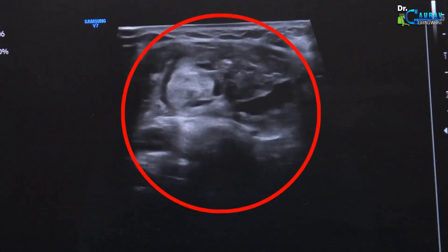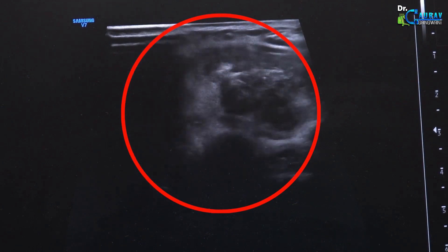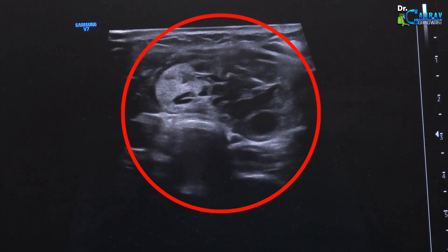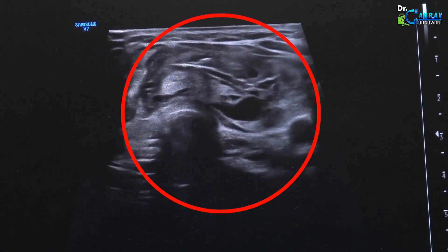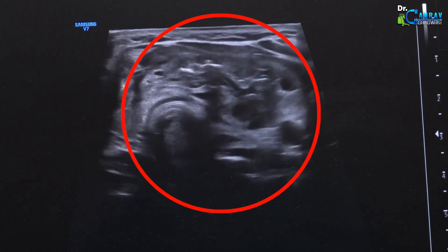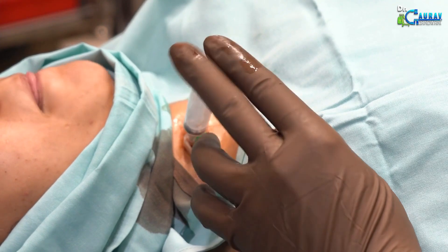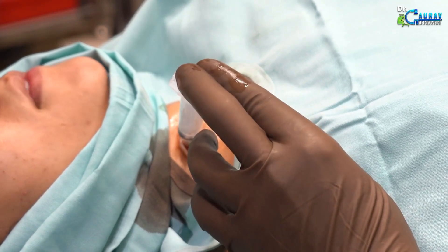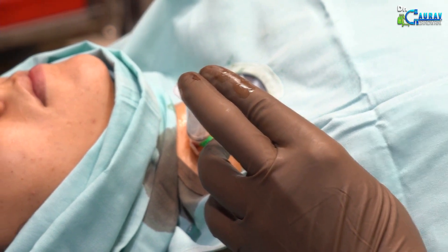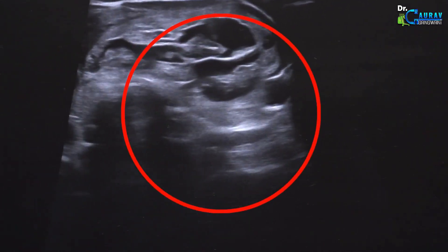Once all the fluid is drained and only the solid white part remains, we can begin our thermal ablation process. With a small needle antenna, we can completely treat the solid area using microwave rays. Throughout the procedure, we will continue to talk to the patient so that we can monitor their voice. At any point, we should not do anything that could damage the vocal cords, as this may lead to a change in the patient's voice.